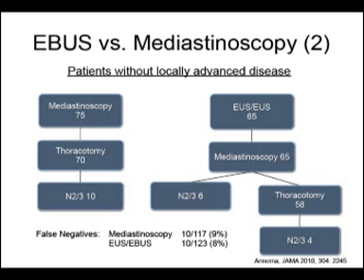So of the patients who were N0 by mediastinoscopy, these underwent surgery, and 10 patients were found to have occult metastatic disease in the N2 or N3 nodes. In the group of patients who were EUS negative, these patients underwent mediastinoscopy. A further 6 patients were found to have occult mediastinal nodes. The remainder underwent thoracotomy. So basically, the false negative rate for mediastinoscopy was 9%. The false negative rate for endoscopic ultrasound and EBUS staging was 8%.